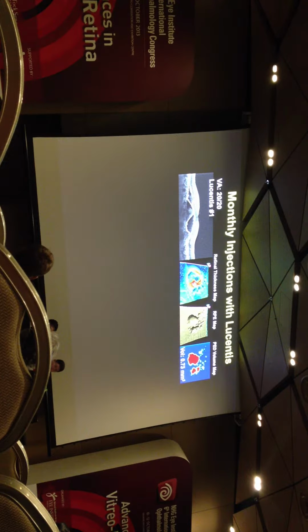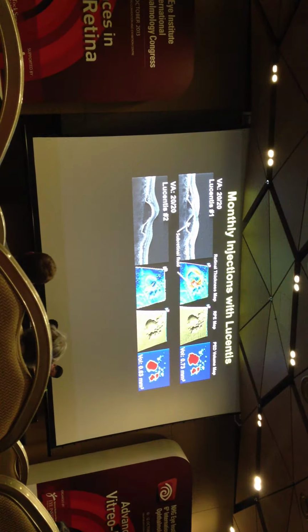Here's what the patient looks like at baseline. Notice the vision is good because you don't have cystic maculopathy here. There's just fluid under the retina, and the foveal contour is good. So the vision is good, so we're not going to be able to follow vision here. So here's the subretinal fluid, and we treat with Lucentis.